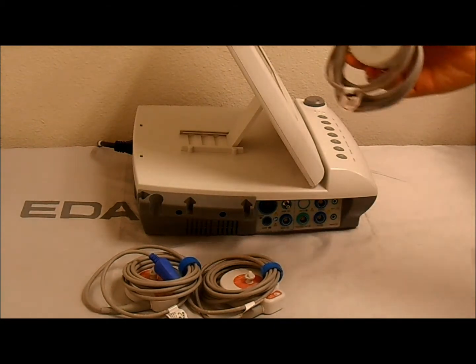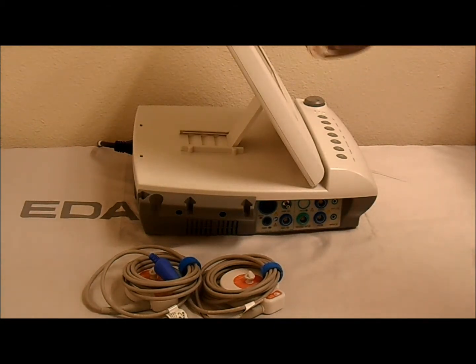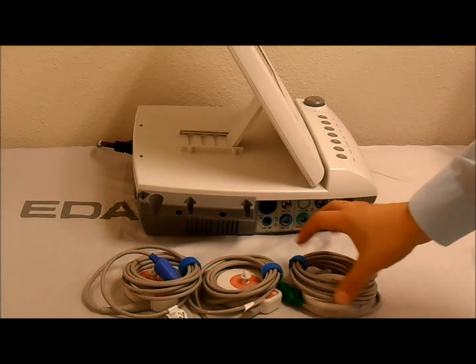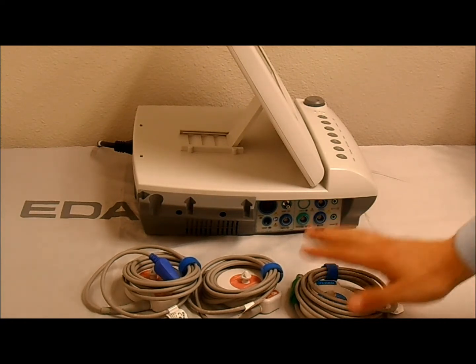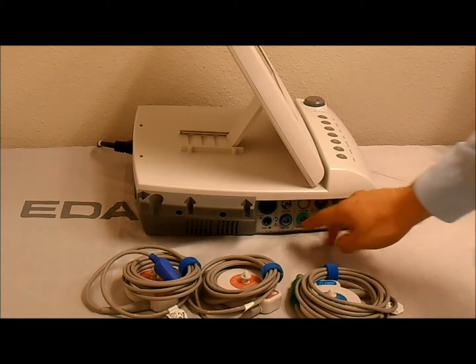Next, we have the Toco transducer. This is the pressure transducer. This is how you can have a reference reading of the intensity of the contraction. So this connects on the Toco port of the monitor.